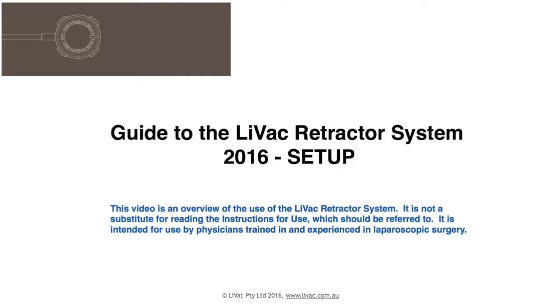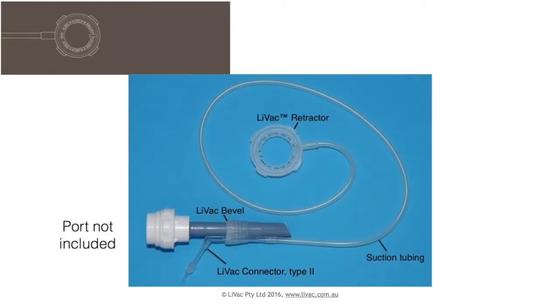This guide to setting up the Livak Retractor system is an overview and is not a substitute for reading the instructions for use. The system comprises the circular retractor attached to suction tubing and our new Type 2 connector, which can be optionally used with the Livak bevel for Hasson technique.